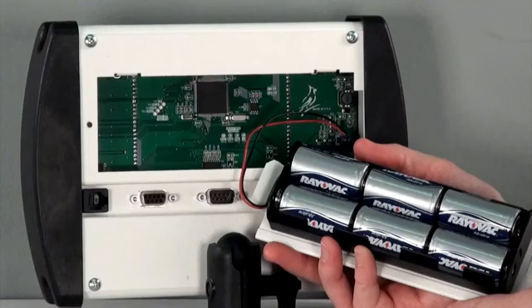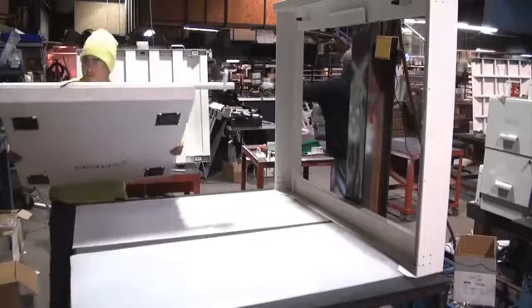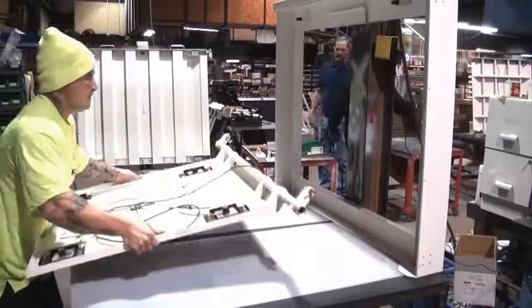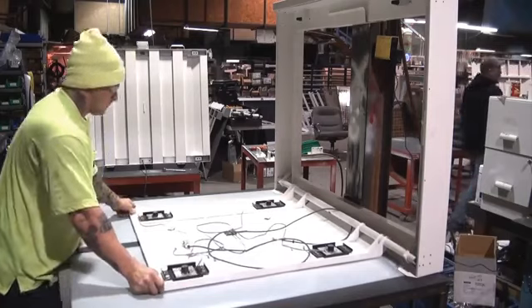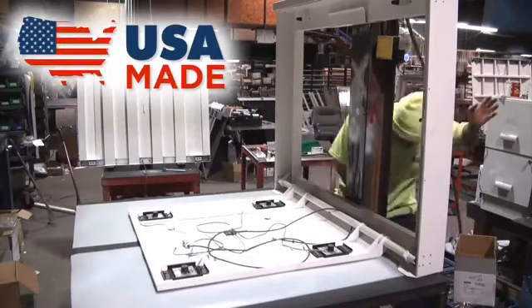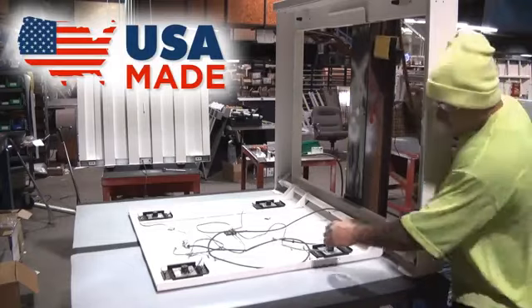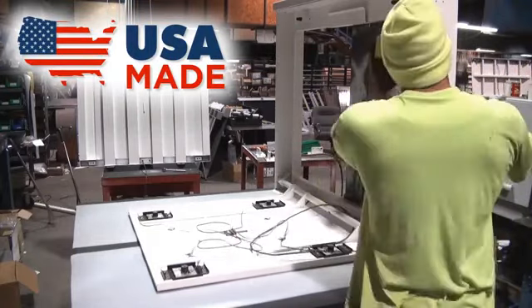The 7550 operates on six C-size batteries or an optional AC adapter. From the load cells, to the digital weight indicator, to the steel scale construction itself, the 7550 is entirely manufactured in the USA at Detecto's factory in Webb City, Missouri. When you buy a 7550, you're putting Americans to work.